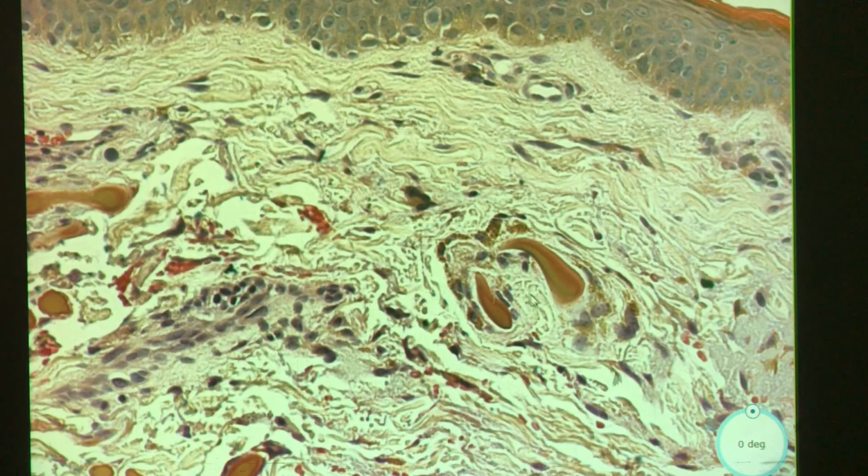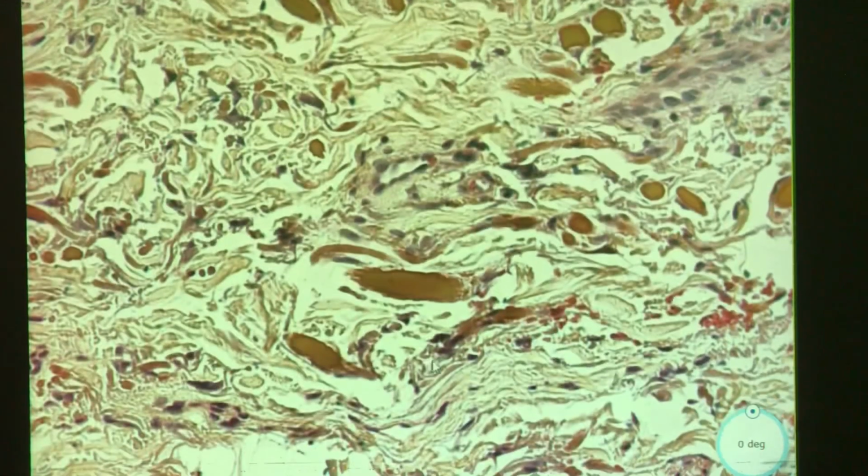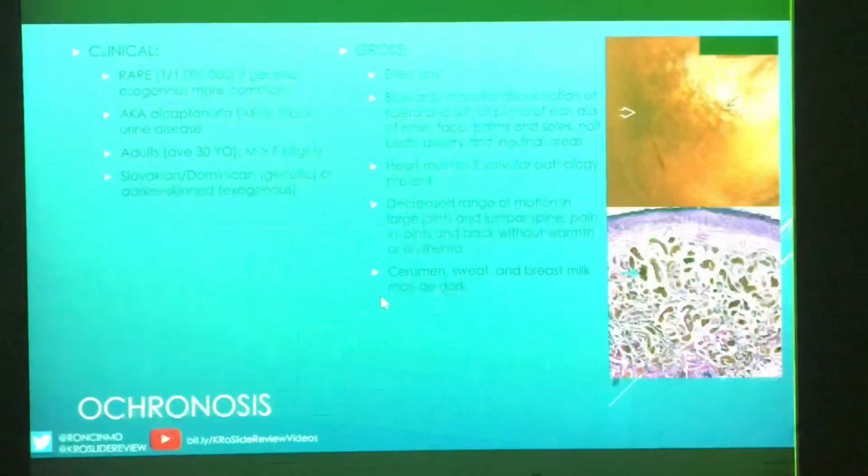Yeah, this one looks weirdly horn, crescent, banana. Banana, there's your other buzzword, yes. But most of these are not banana looking. There's a few, but it's the pigment, the color. Yeah. You do have some bananas, so what? So you clearly know this. Yes, this is ochronosis.